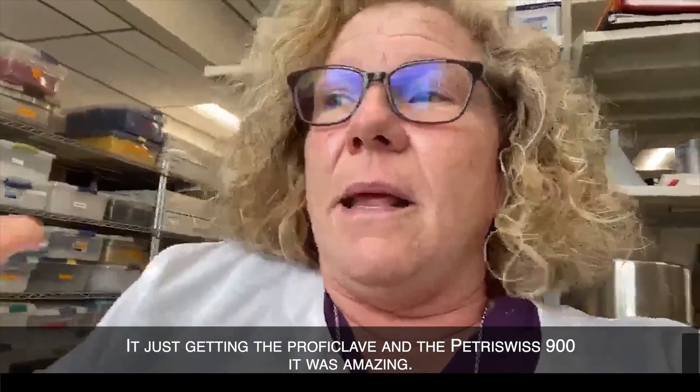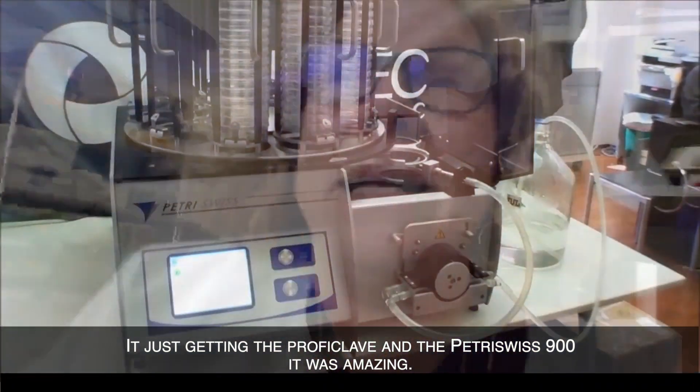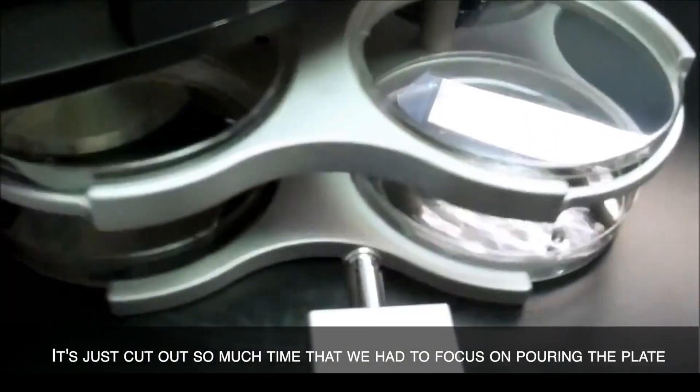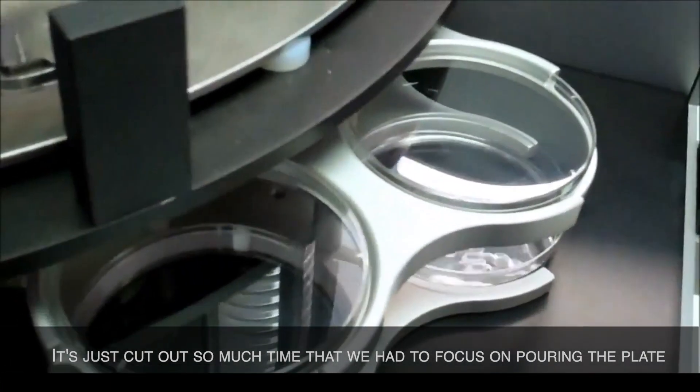Getting the Proficlave and the Petri Swiss 900 was amazing. It just cut out so much time that we had to spend focusing on pouring the plates.